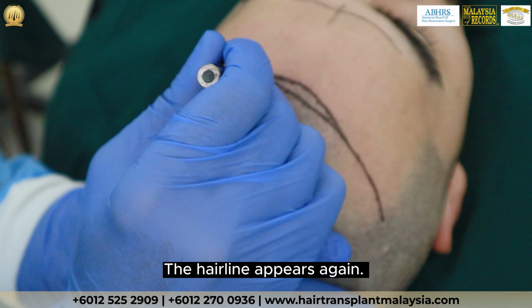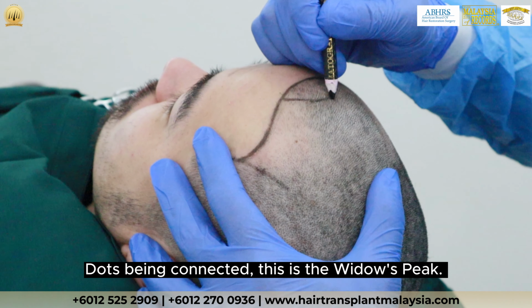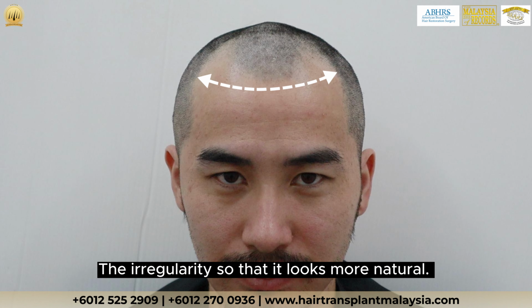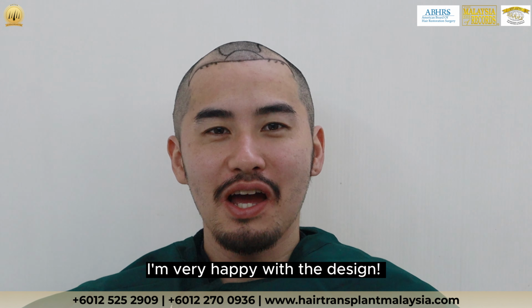As we connect on this side, on the left side, the hairline appears again. Dots being connected. This is the widow's peak. The irregularity so that it looks more natural. This is irregularity or zigzag. I'm very happy with the design.